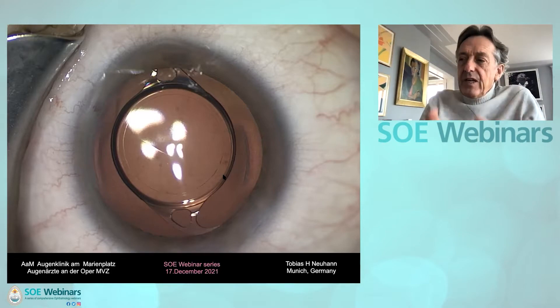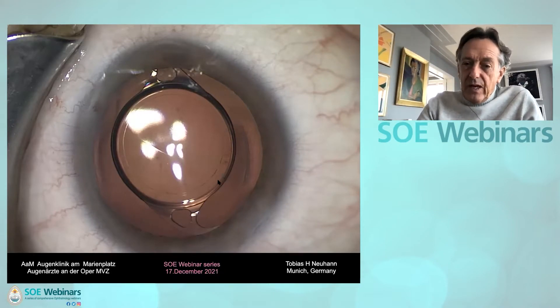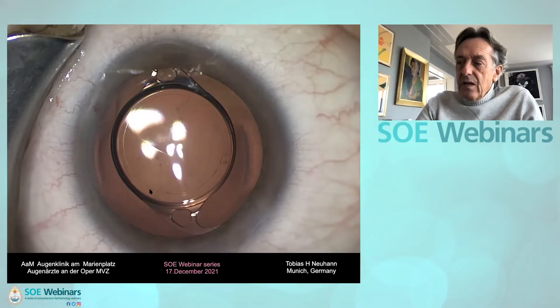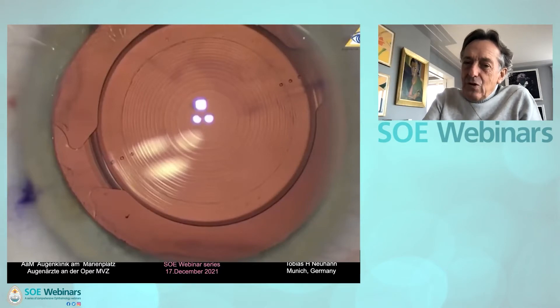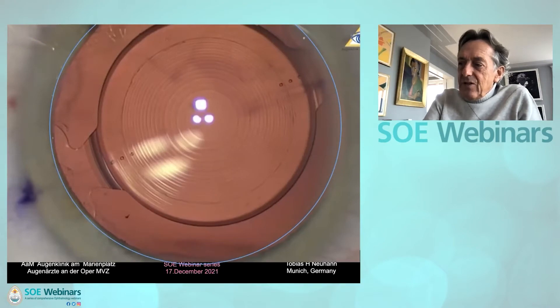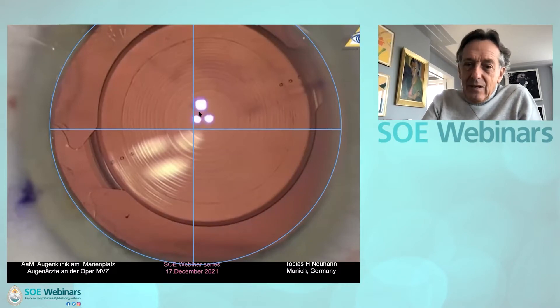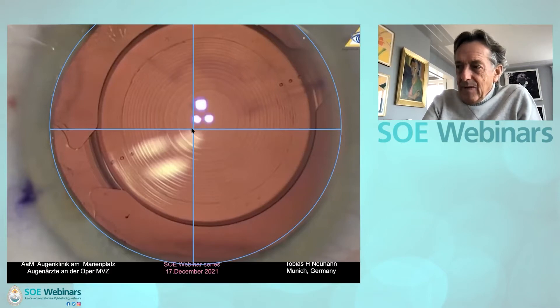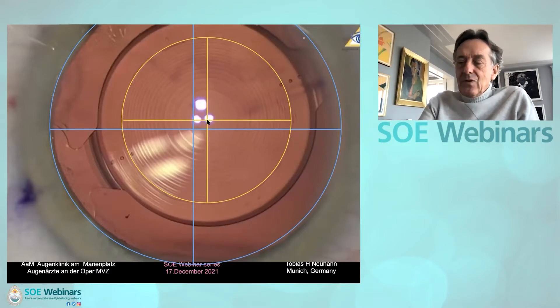It is clear that every capsule-bag implanted IOL centers within the capsule-bag equator. But it is also important that the overlay of the capsulotomy is even, otherwise we get induced tilt as seen in the previous case. Here is a beautiful case with a trifocal toric IOL — a pupil-decentered optic, but perfectly centered in the capsular bag. This implant shows no change in the angle alpha. The blue circle indicates the pupillary margin, and the center of this pupillary margin would hit the first inner line of the diffractive optic. The yellow line indicates the capsulotomy margin, and the center hits precisely the central part of this trifocal IOL, thanks to the apex centration.